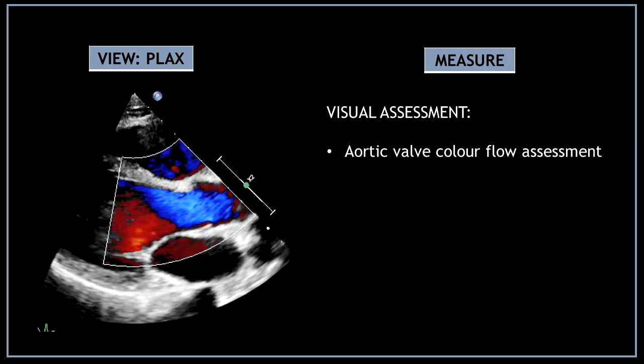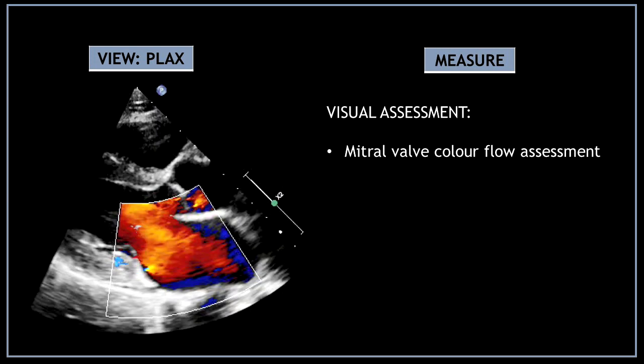On the parasternal long axis view, using color Doppler, do an aortic valve color flow assessment. On the same view, move the color Doppler box to do a mitral valve color flow assessment.